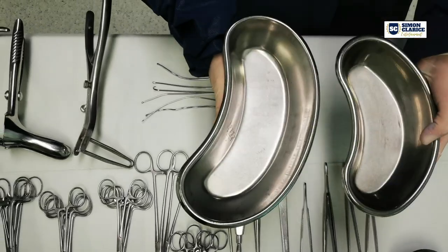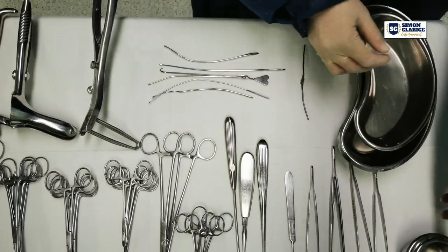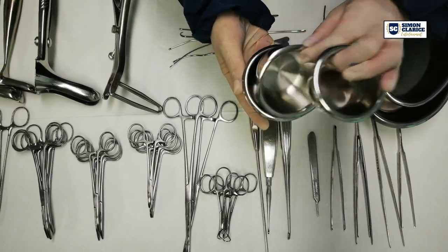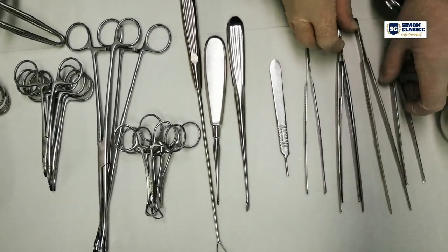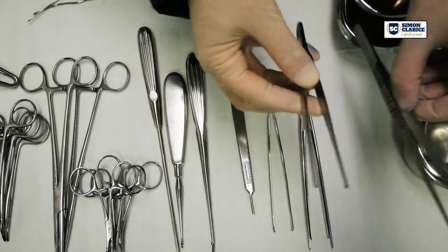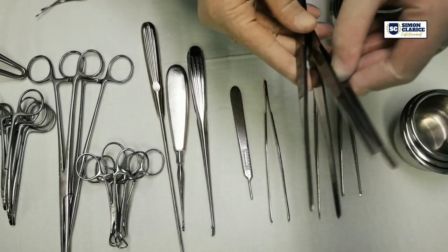Two different sizes of kidney dishes. Three gullypots. Five tissue forceps. One tooth forcep. A DeBakey forcep. Two non-tooth forceps.